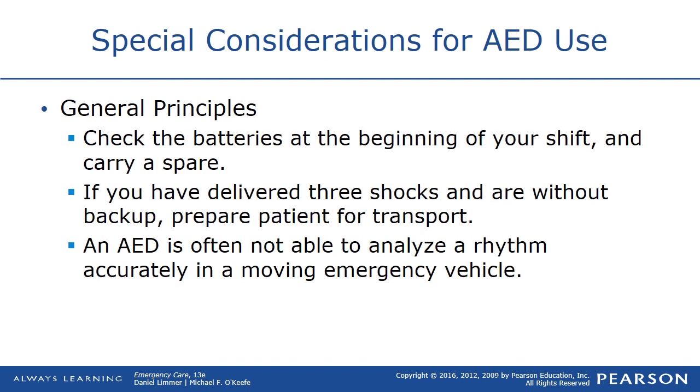Check the batteries for an AED at the beginning of your shift and carry spare batteries. If you have delivered 3 shocks and are without a backup, prepare the patient for transport. An AED is often not able to analyze the rhythm accurately in a moving emergency vehicle, so you might have to pull over to get a better recognition.